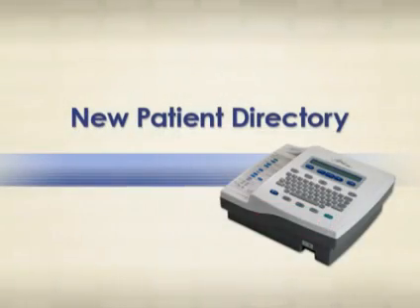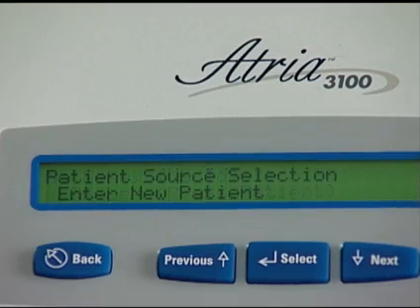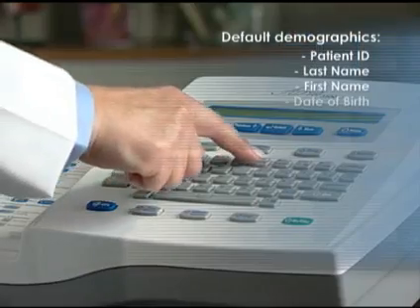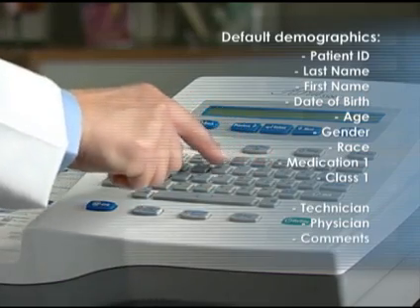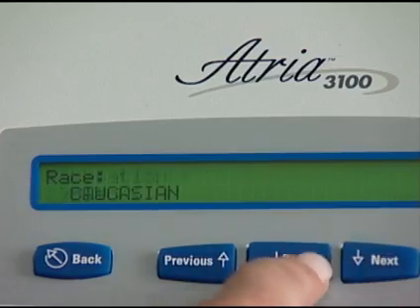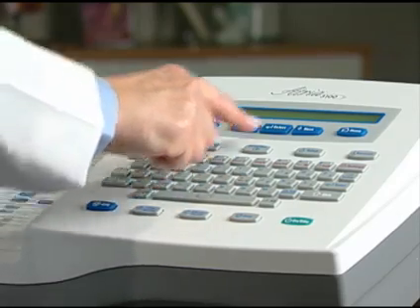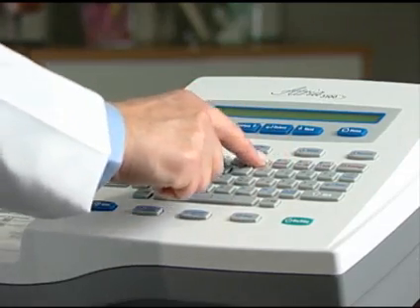To enter demographic information for a new patient, press the Patient key. Enter New Patient will appear. Press the Select key. Now you can fill in the default demographics. When a field offers multiple choices, such as gender, use the Next key to choose male or female. For race, use the Next key to scroll down to the appropriate selection. After each entry, press Select.